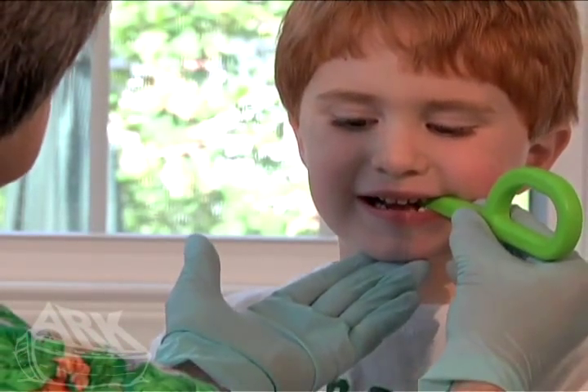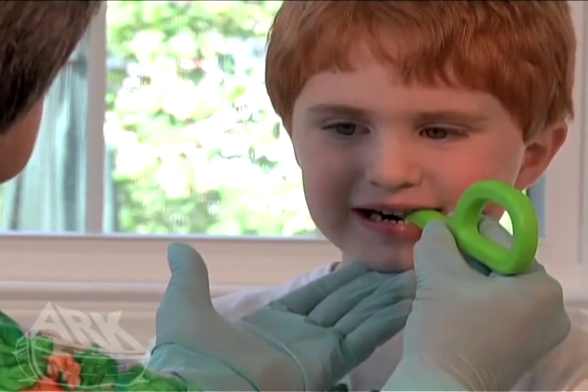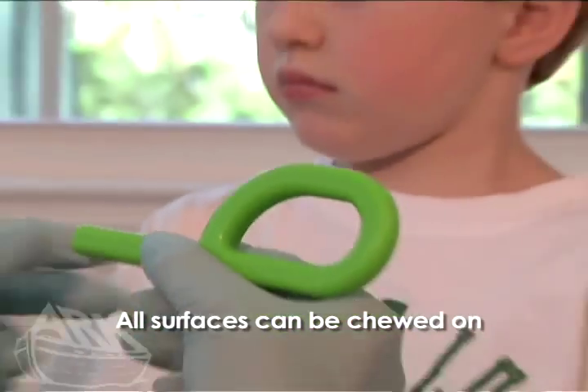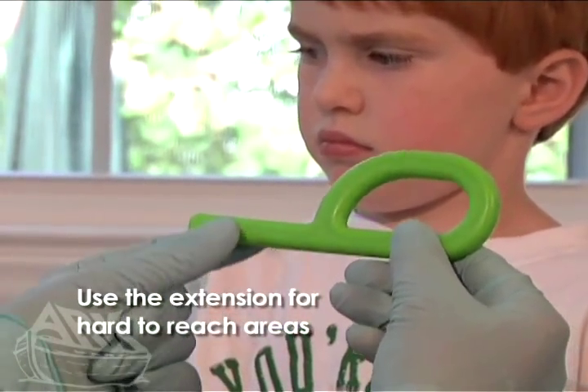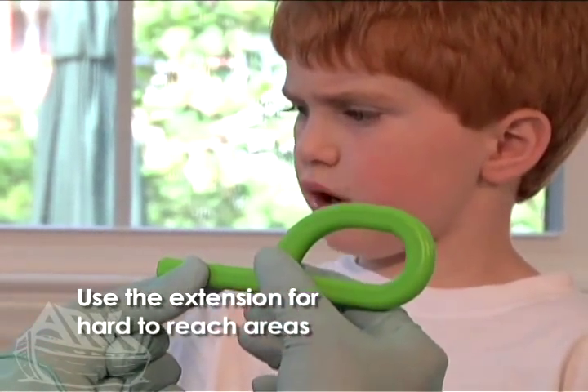As a mouthing tool, ARX Grabber provides an opportunity for the mouth to play through jaw movement, tongue movement, and oral stimulation. While all surfaces of the grabber can be chewed on, the extension of the grabber allows the child to reach areas further back on the tongue and between the gums and teeth.